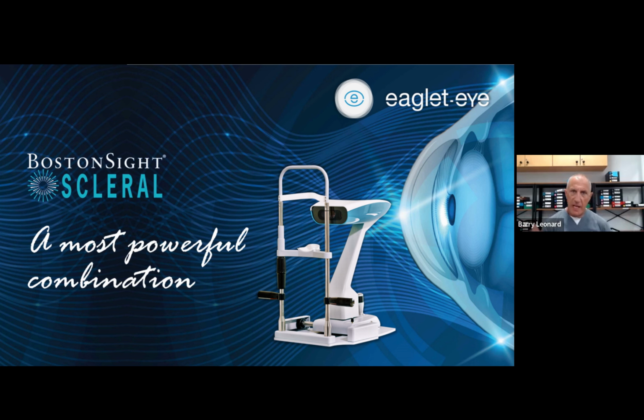Then you can send this data off through DirectConnect, or even if you're going to do a standard lens, we can still use the Fit Kit from Boston and do that. You're still going to get more data and more knowledge of how that lens is. So we hopefully get that first lens, one and done. And I think that's the goal of these freeform lenses, and we're getting there. We have many lenses that are certainly very acceptable, if not ready, done. But I'm a perfectionist. We all want to make small changes and get things perfect.